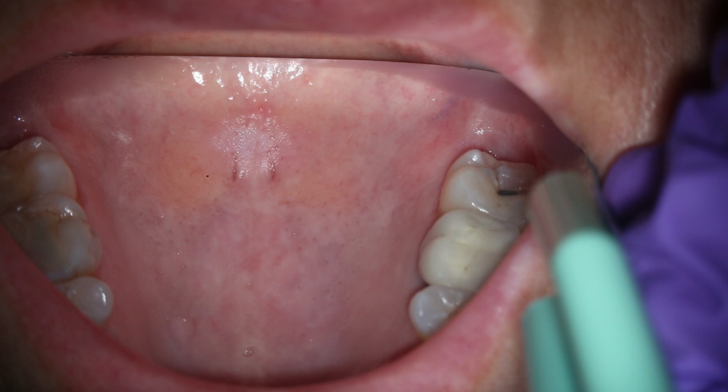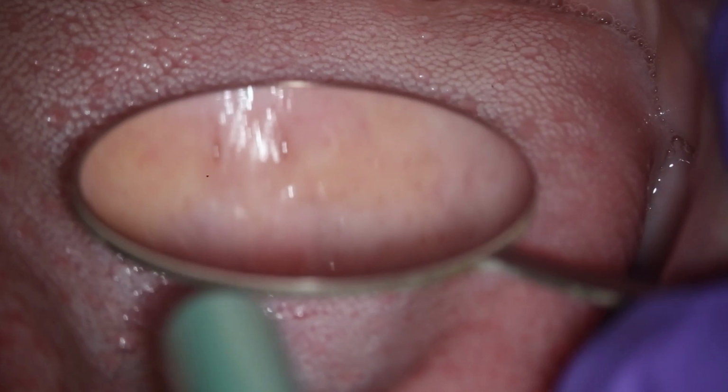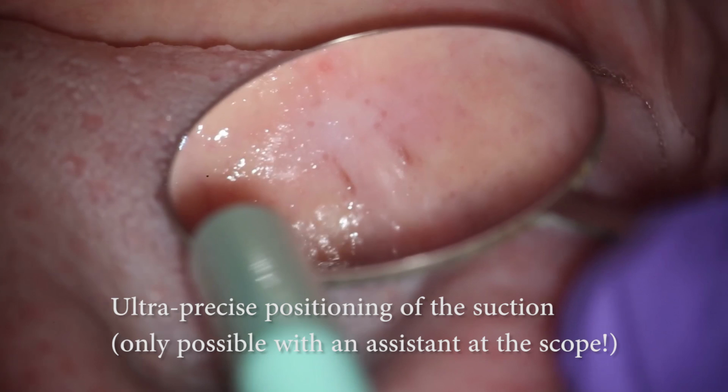Another factor in getting really good photography is the placement of the suction device. You'll notice here that Joy has placed the suction device to defog the mirror, but has kept it out of the field of view of the actual picture, so it is not blocking anything. This is more noticeable with a smaller mirror. Notice how Joy has positioned the suction precisely in the right spot to defog the mirror and allow me to get very precise focus. If I'm fighting fogging of the mirror all the time, then taking these photographs is going to take me a lot more time, and I'm going to get unpredictable results.